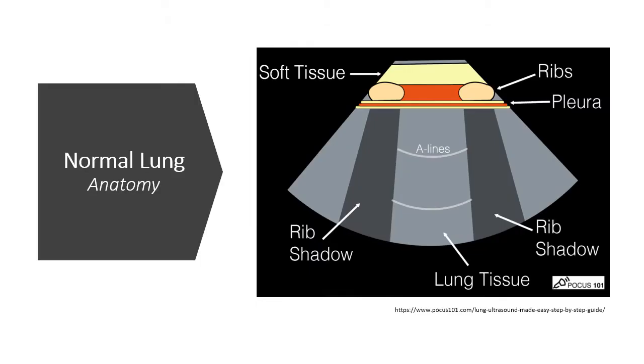All right, so we're going to move on to different types of pathology, but first of all, we want to look at what a normal lung looks like with ultrasound. So first, I want to show you what a normal lung looks like in a schematic.